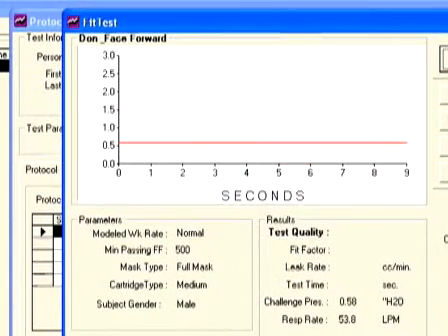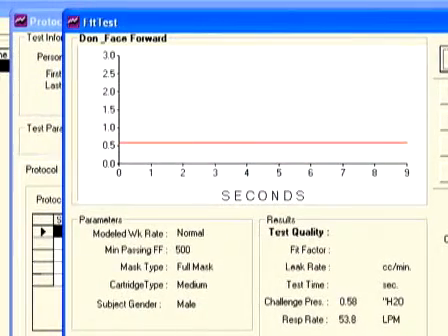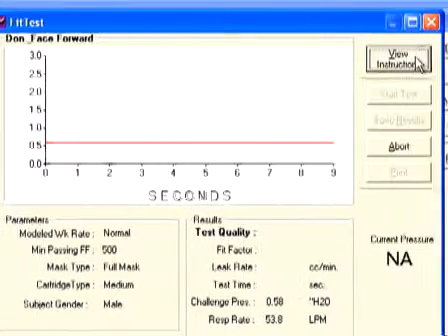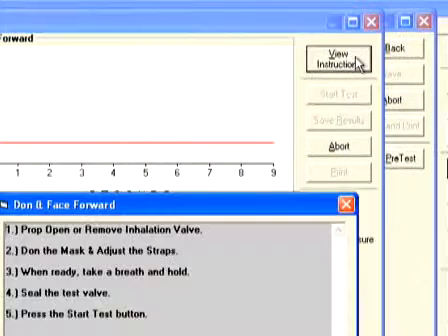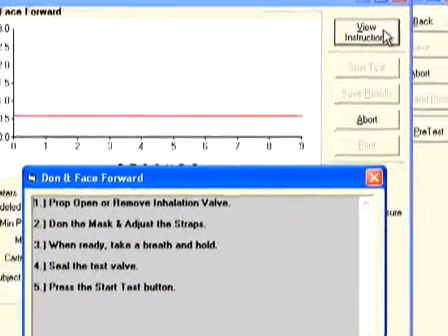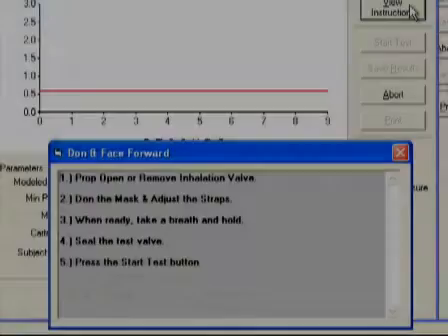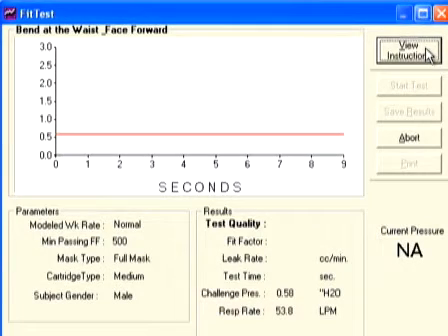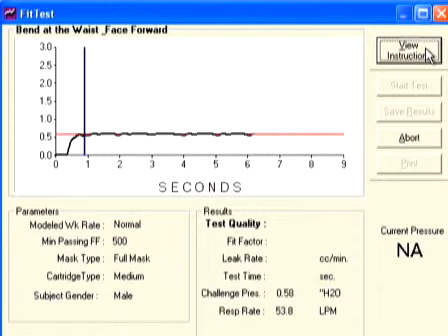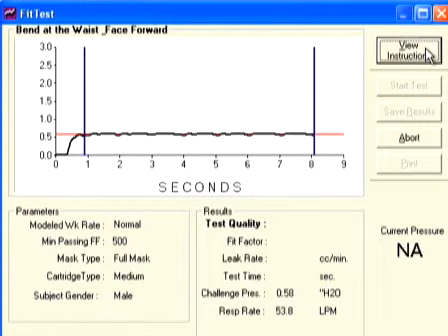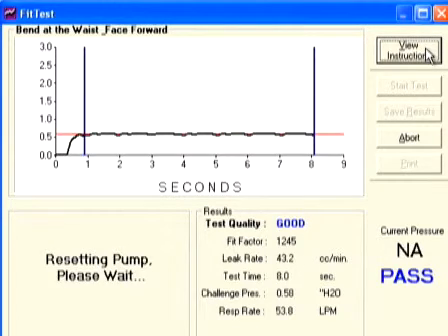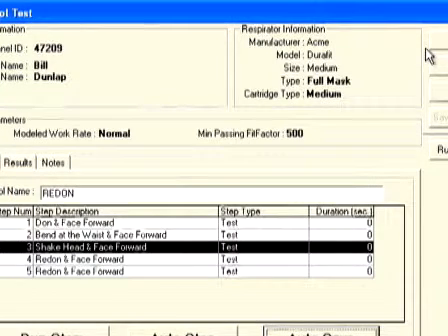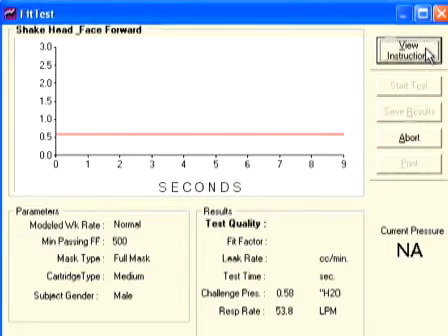The name of the test shows across the top of the test step window. To see detailed instructions for that particular step, click on view instructions. When viewing the test on the computer screen, you are able to view a more detailed graph line while the test is taking place. After the step, you can clearly see if the step passed or failed and you will see the resulting fit factor.